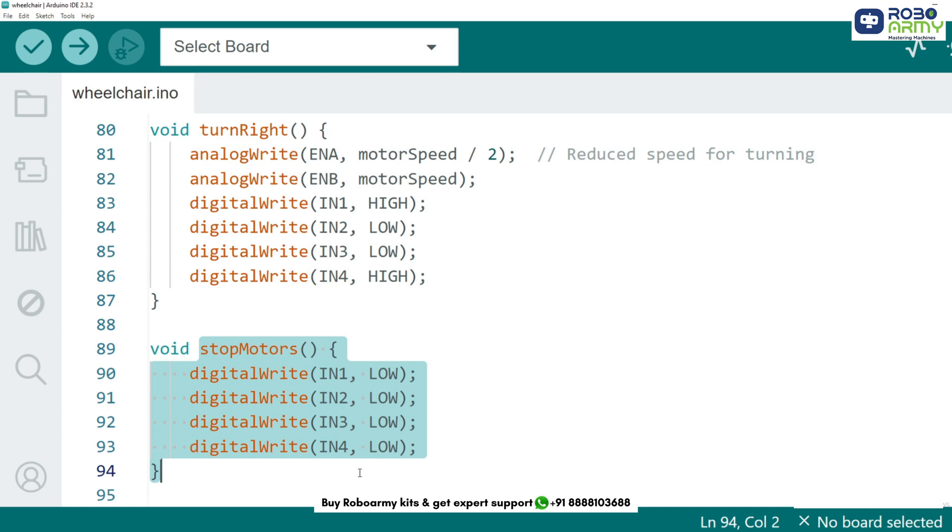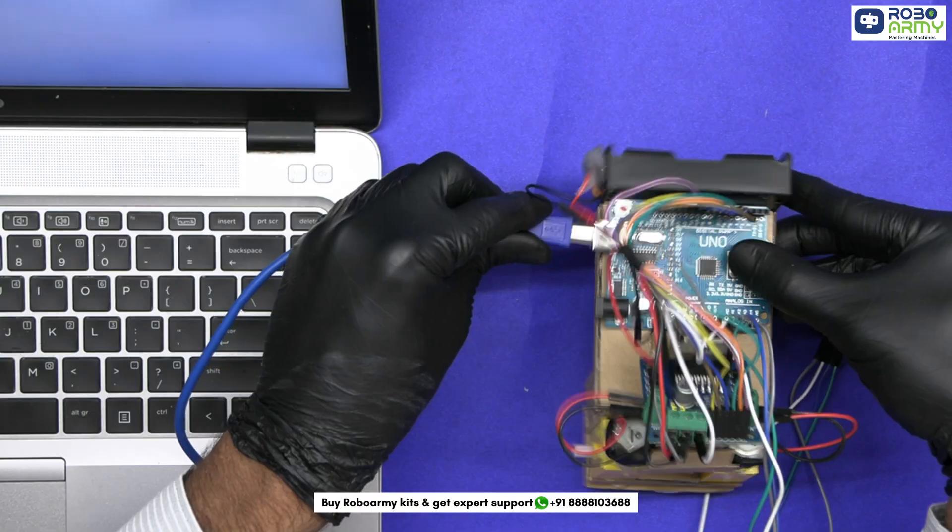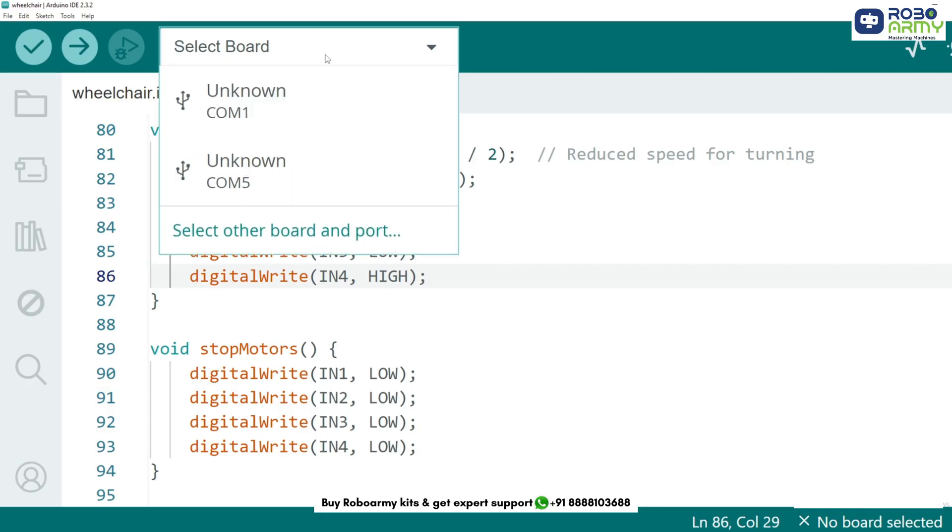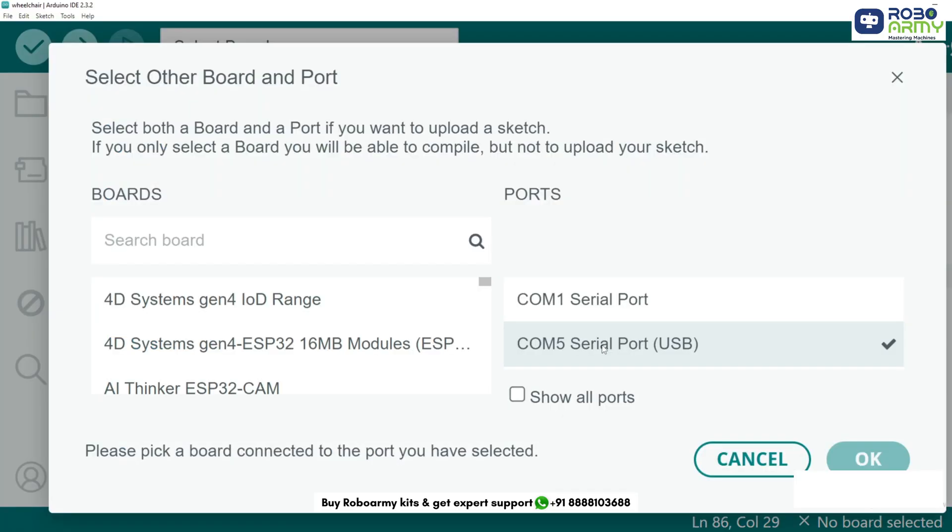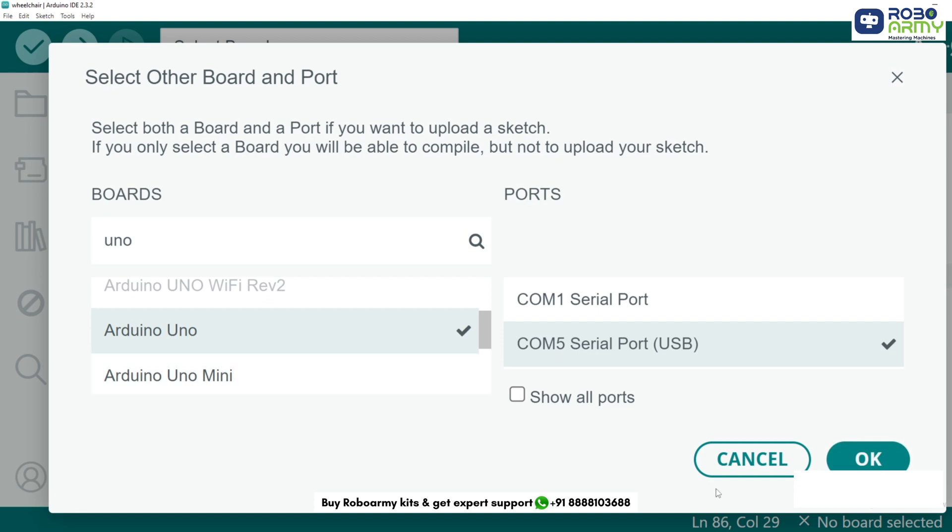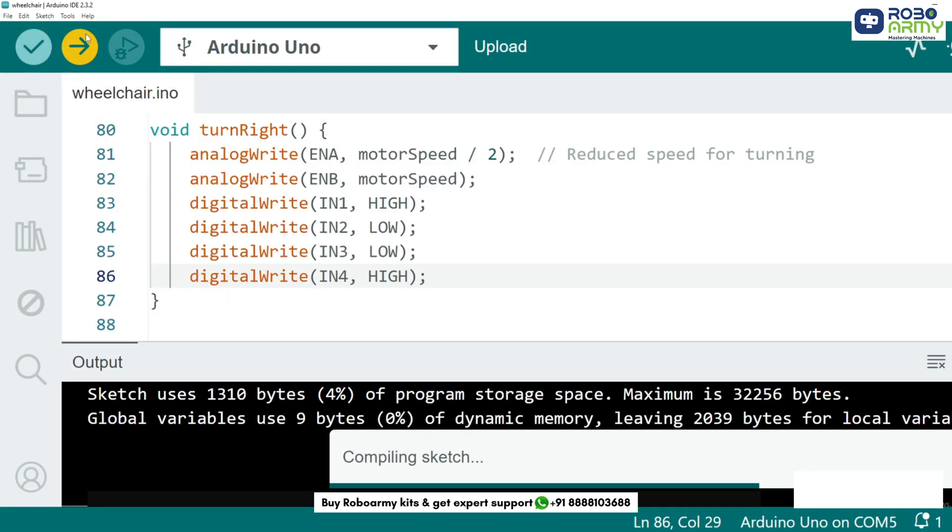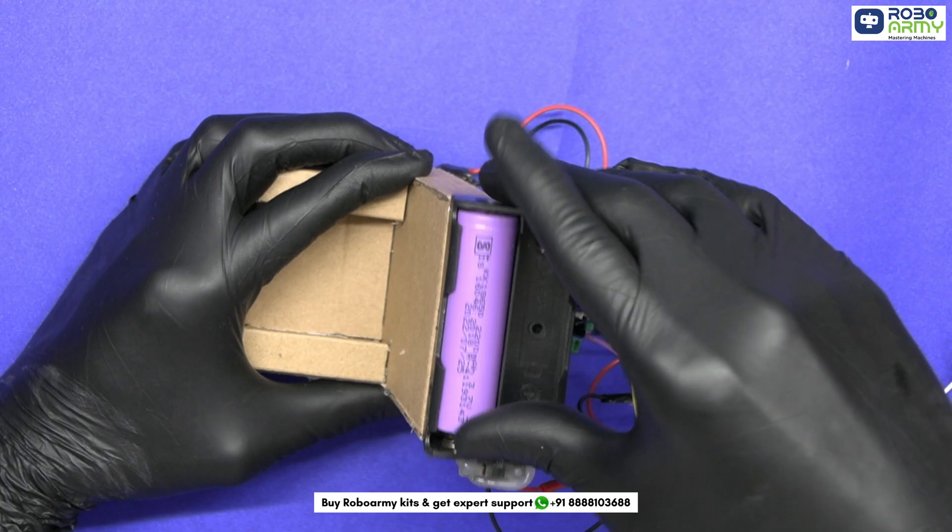Now let's upload our code to the Arduino. Connect your Arduino Uno to your computer using a USB cable. Select port and board in the Arduino IDE. Click the upload button. Once the upload is complete, let's test the project.